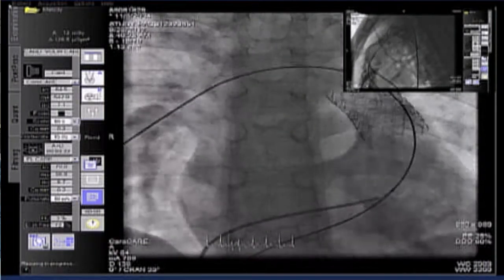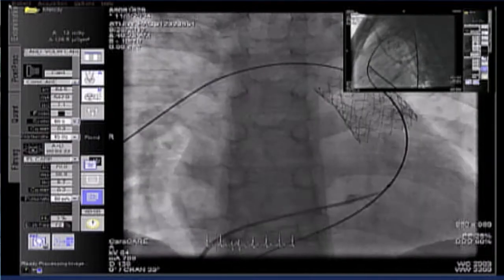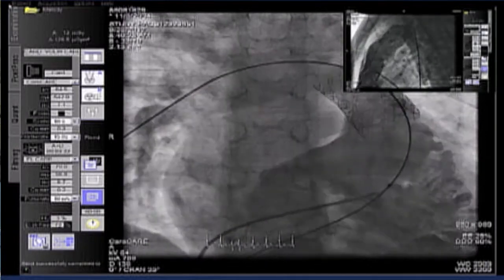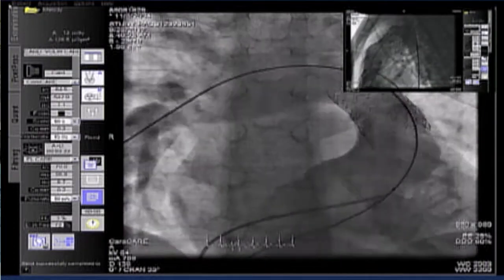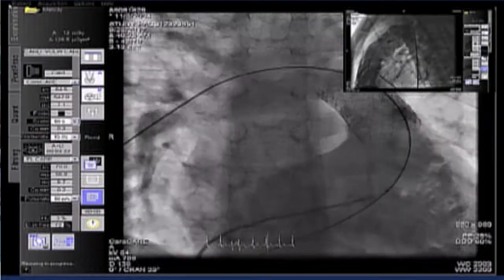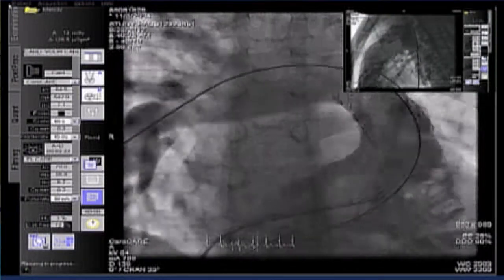So you see on the proximal, if you would put your stent on the dilatator, if you would put the stent in the proximal part of the stent, and you don't, yep. We lost transmission again. The valve is almost in place. Just a second. We pre-dilate.